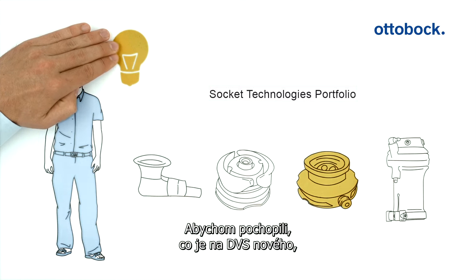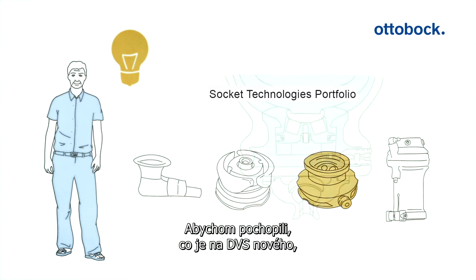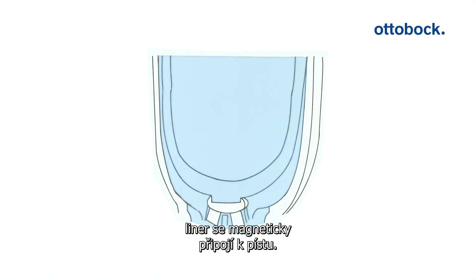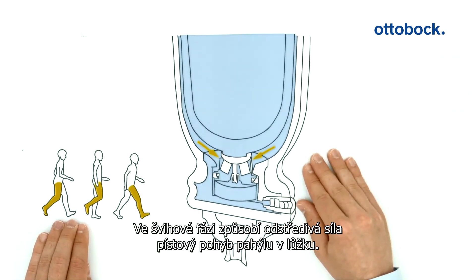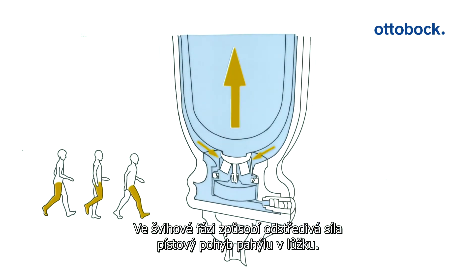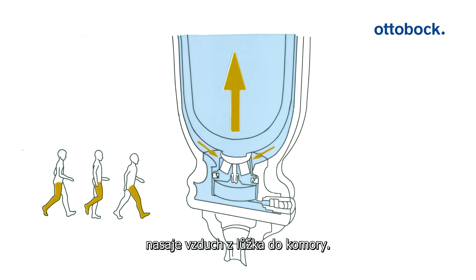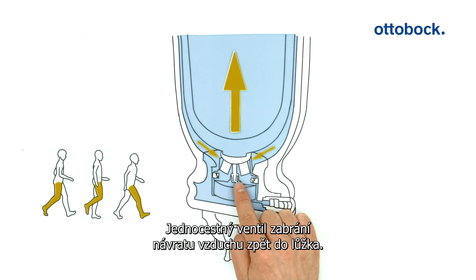To understand what is new about the dynamic vacuum system, we'll have a look at its functionality. After the user steps into the prosthetic socket, magnetic coupling of the liner and piston occurs. In the swing phase, the centrifugal force causes pistoning of the residual limb in the prosthetic socket. The pressure difference between the socket and the cylinder chamber forces the air out of the prosthetic socket into the cylinder chamber. A one-way valve ensures that the air cannot flow back.